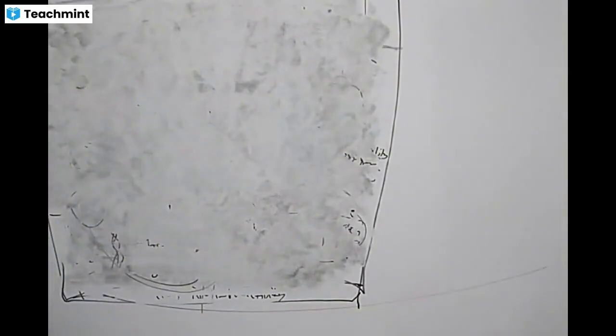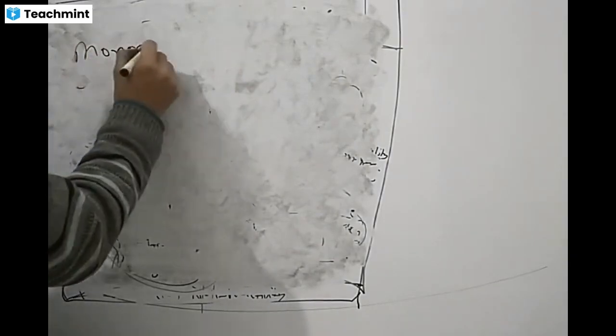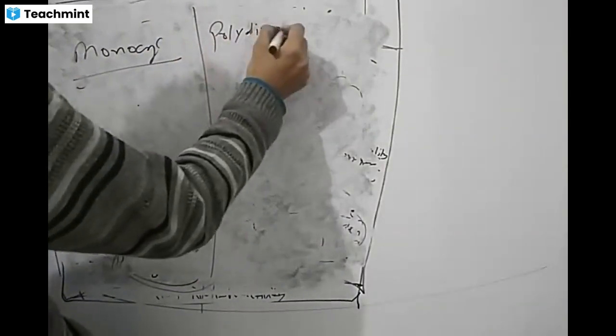Then there are two materials. One is monocryl and one is polydioxanone.